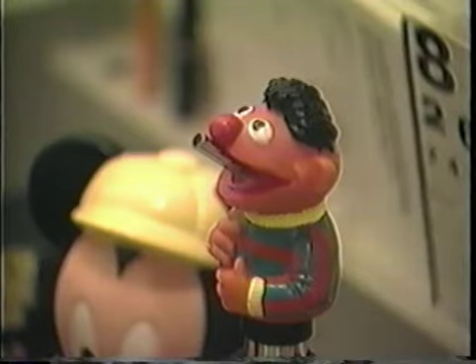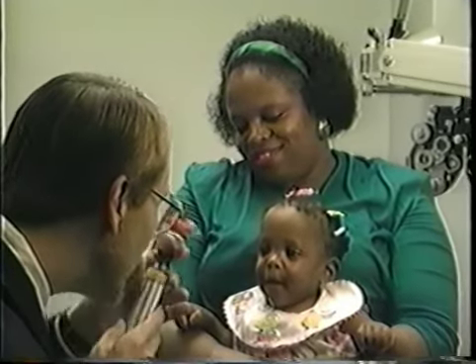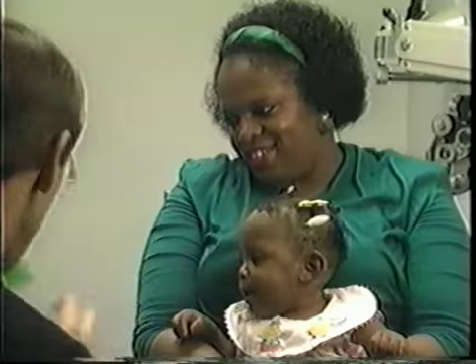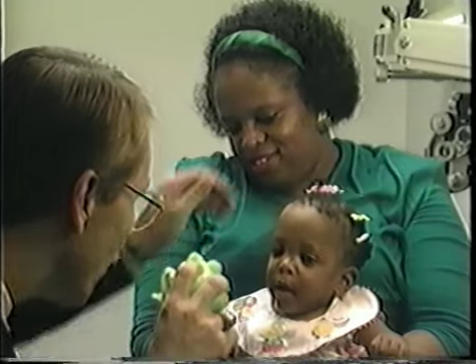I encounter numerous patients who are either unable to fixate or cooperate sufficiently for accurate assessment of ocular motility with cover tests. In these cases, I use corneal light reflection tests to measure the deviation. Since many of these patients are children, I place a bright, detailed toy over or beside the light. It also helps hold their attention to whistle, talk, blink the light, and to change the toys frequently. So I often have to use the concept of one toy, one look.